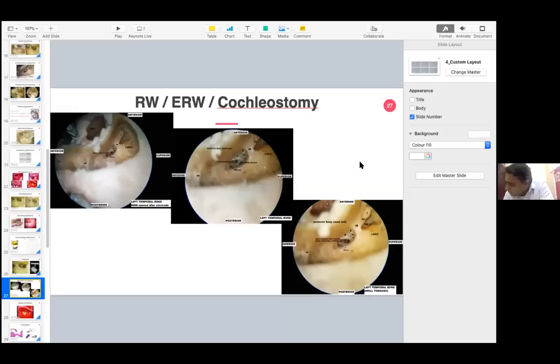Now, what was the third question? The types of cochleostomy. So basically there are 3 routes to enter the cochlea. You can also classify it as 2 routes. One is via the round window, that is called the round window technique. The other one is the cochleostomy technique. Cochleostomy means opening of the bony cochlea. If you drill along the round window membrane, it's called extended round window.